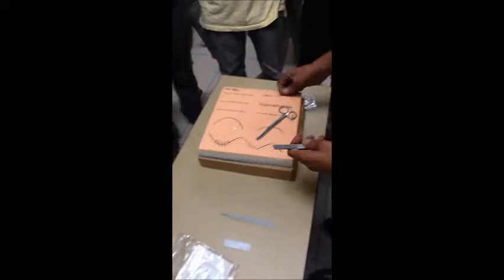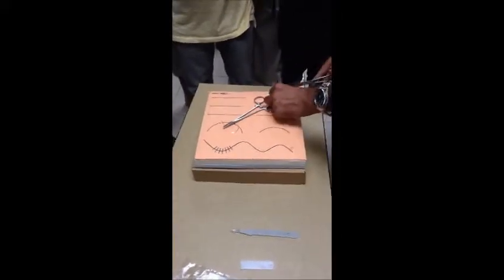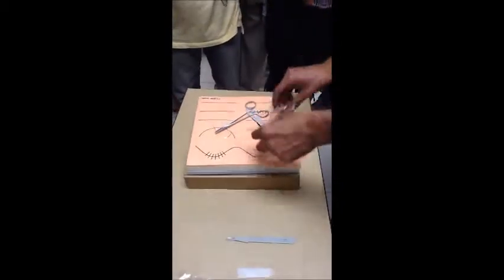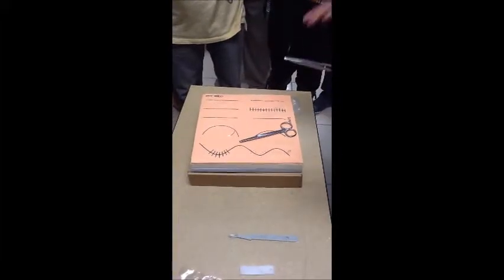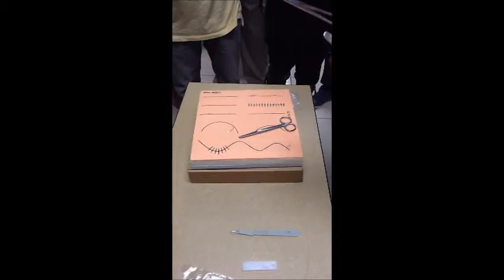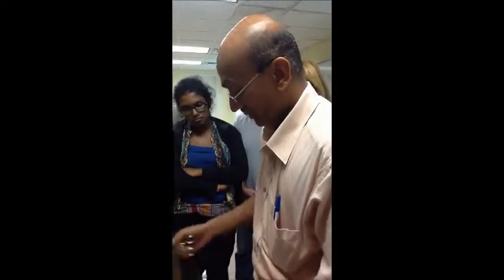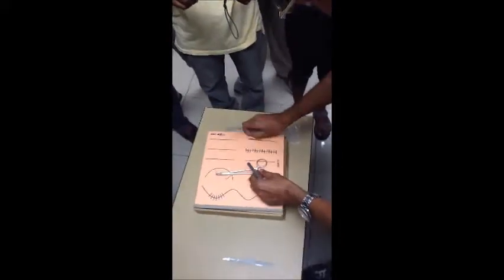Though this is skin, we usually use this continuous technique, as he showed in the second video, on the linea alba. After you have done a laparotomy and whatever procedure had to be done inside, first you have to close the linea alba. The linea alba is a tough fibrous layer in the midline, where all the fibers mesh in the middle. So let's assume that this is the linea alba. Before we start with the procedure, let me remove all these knots here.